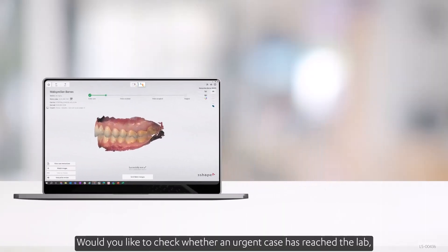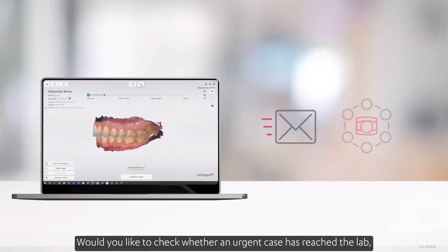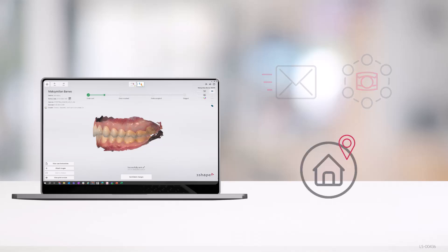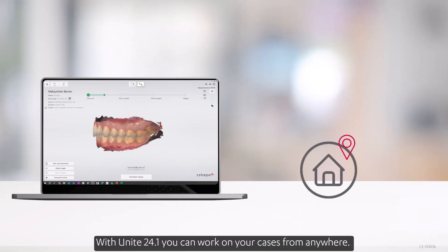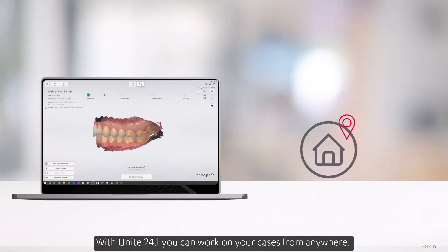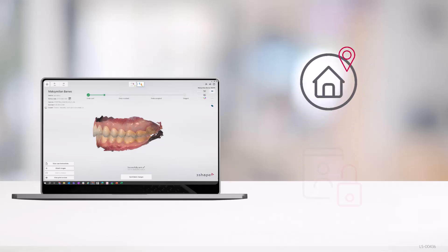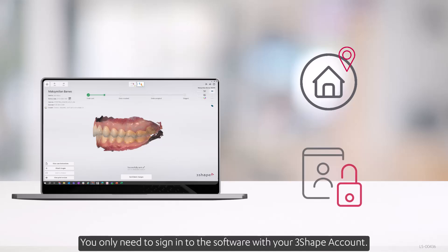Would you like to check whether an urgent case has reached the lab while staying at home? With Unite 24.1, you can work on your cases from anywhere. You only need to sign in to the software with your 3Shape account.